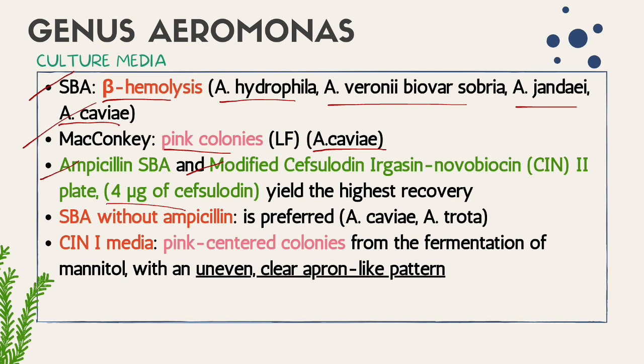So, in order for us to increase the growth of this particular genus, we can use this combination of culture media.